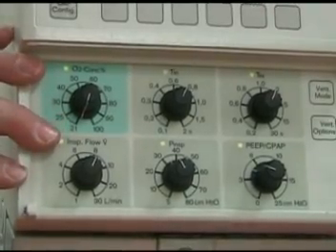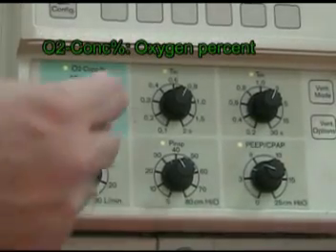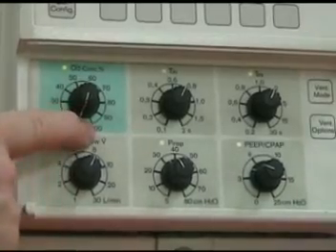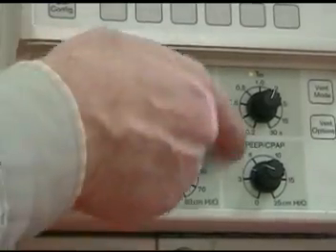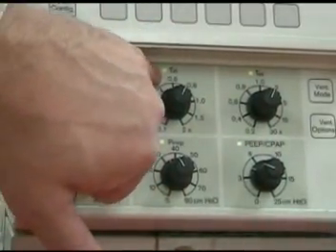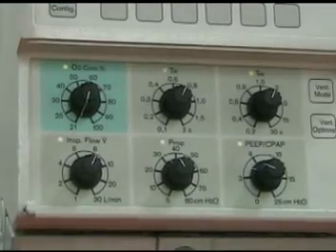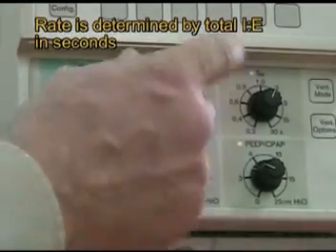Let's take a look at the controls. We have oxygen — shown in light green to help identify it — with variable oxygen settings from 21 all the way up to 100%. In the current mode, all of these controls are functional. We have Ti — inspiratory time — and Te — expiratory time. The patient's rate is maintained by the balance between inspiratory and expiratory time.